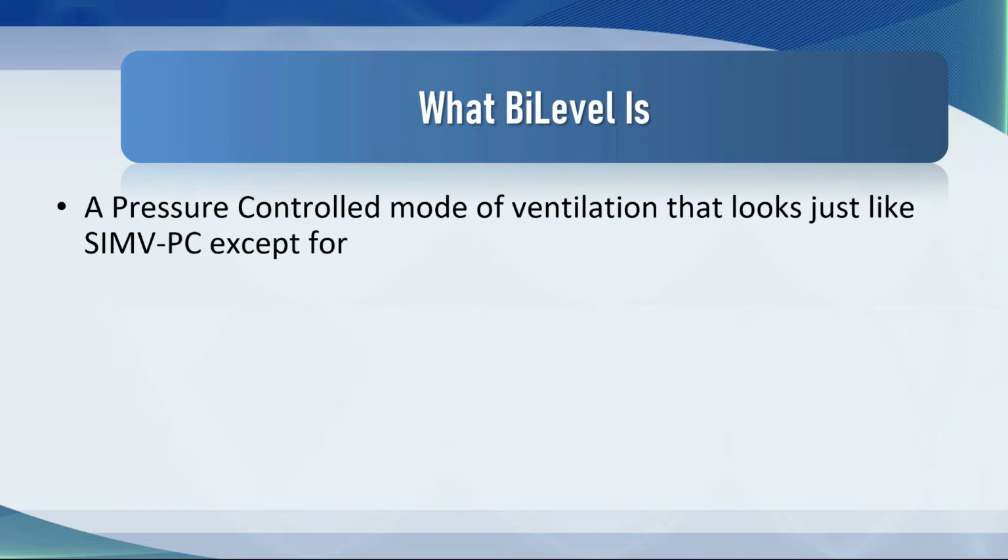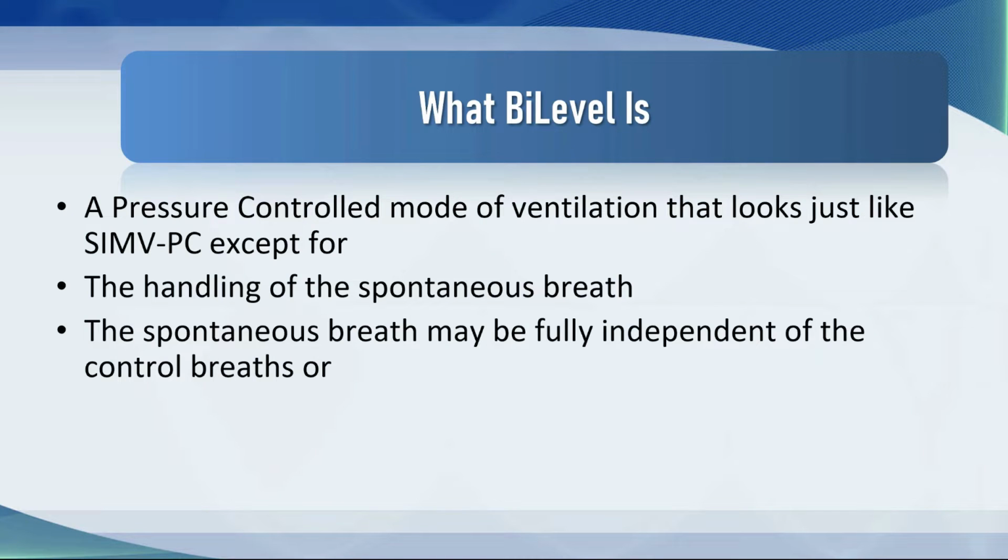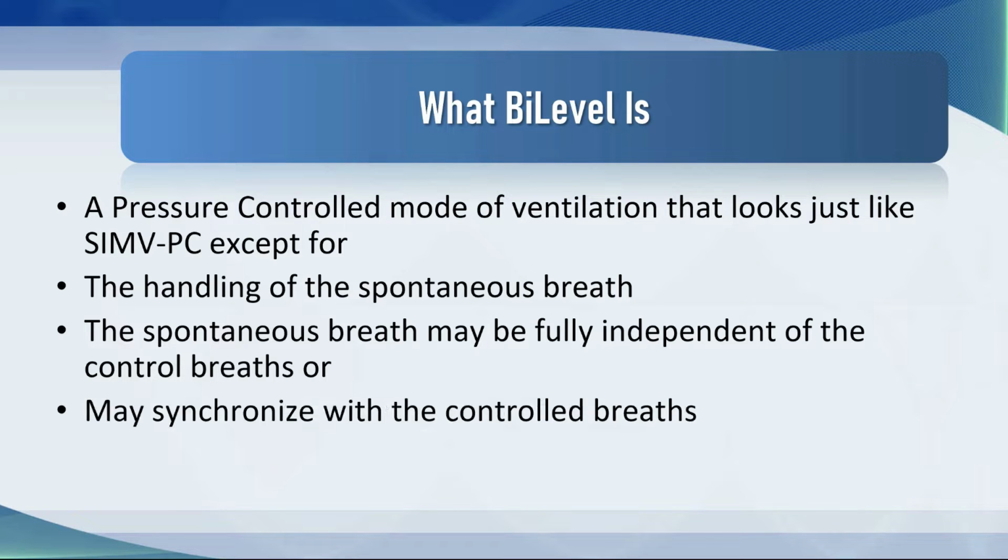Now what this is, is a pressure controlled mode of ventilation that looks just like SIMV pressure control except for the handling of the spontaneous breath. The spontaneous breath is either fully independent of the control breaths or it is synchronized with the control breaths. So this is not SIMV and it's not assist control. It's a different way of handling the spontaneous breaths. And that's what I really want you to understand.